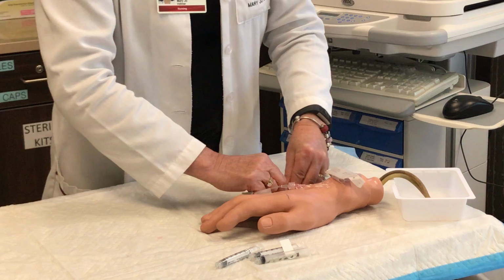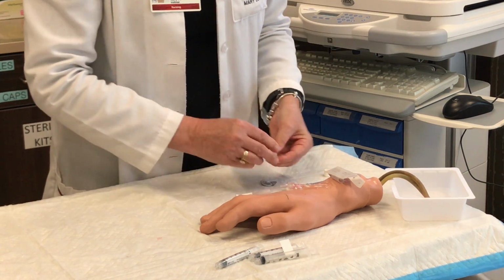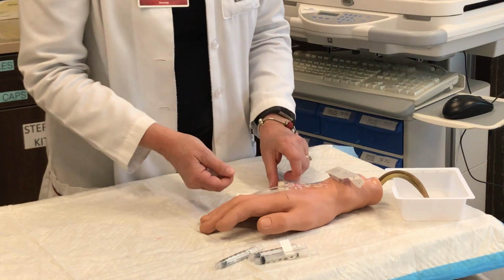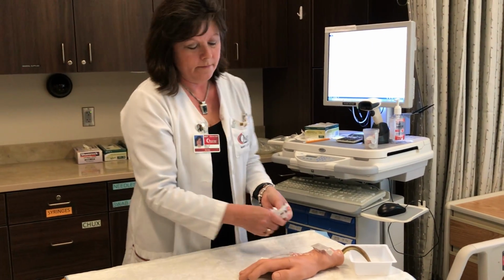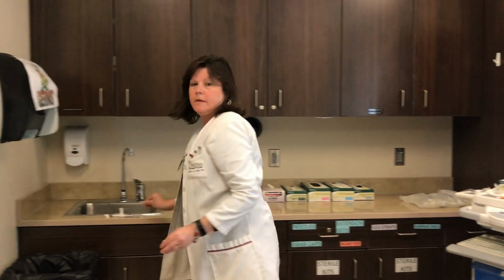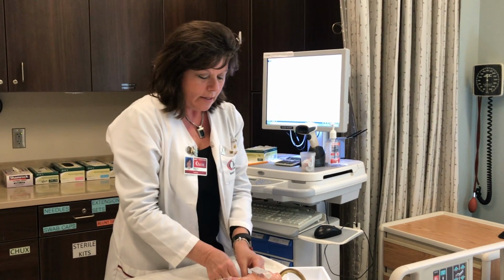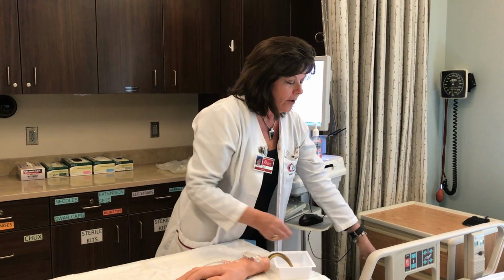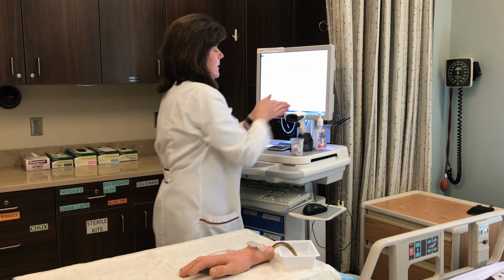Stay with patient for several minutes and observe for any adverse reactions. Dispose of used supplies per agency policy. Reposition patient for comfort, call light within reach, leave patient in safe environment, and perform hand hygiene. Here's your call light, Miss Curtin. Thank you. Are you feeling okay? I'm fine. Are you comfortable? I am. Okay.